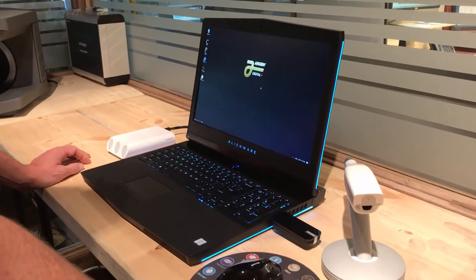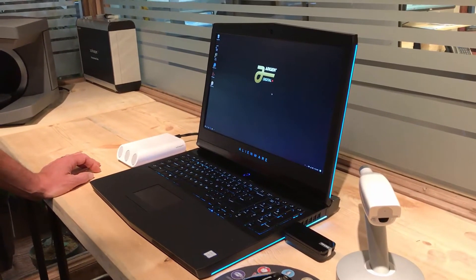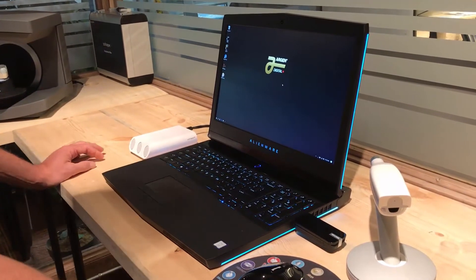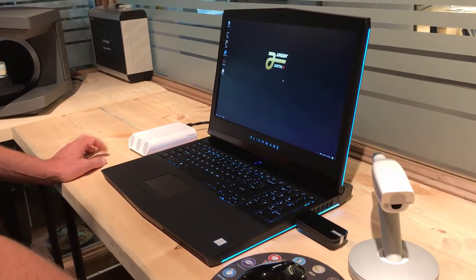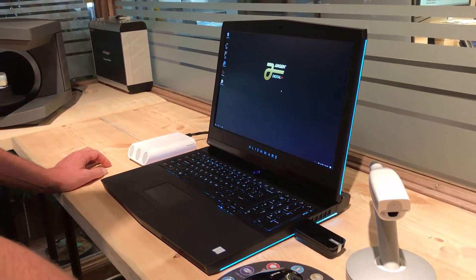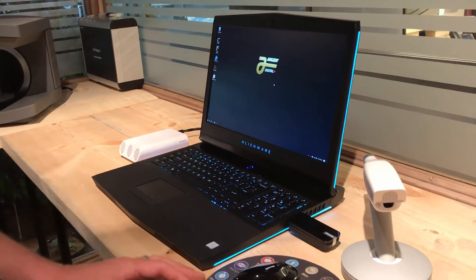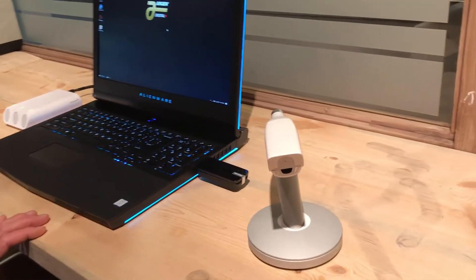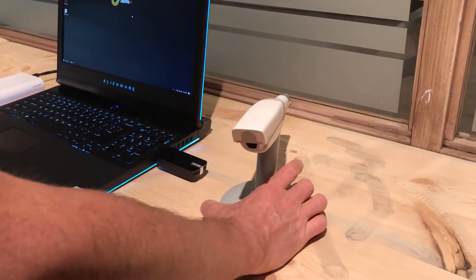We are a Dell reseller, so we were able to get these upgraded — not only to Three Shape's spec but we're running a 1070 video card in this Alienware, so it performs at the highest level for any of our Trios products. The interesting thing we see now is, as I move this wireless mouse over, we see a completely wireless Trios wand — there are no wires attached to the base.